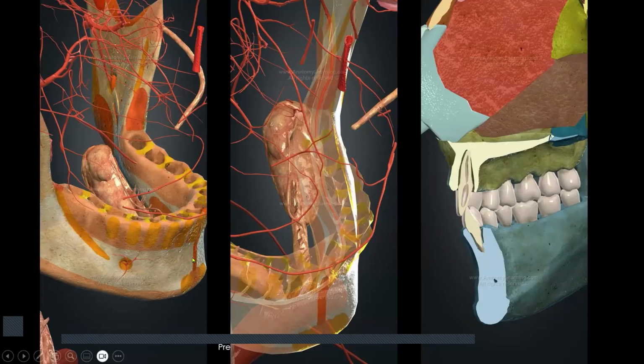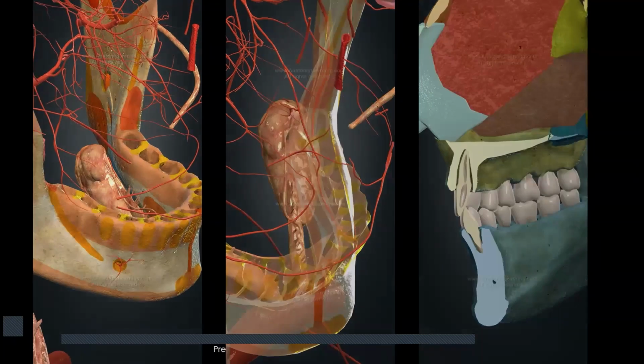So this is how we plan in a mandible for a cortical implant. The locations are anteriorly foramen to midline, and posteriorly the external oblique ridge or the mylohyoid ridge. Okay, this is the anterior and the posterior. When you place a lingual cortical implant, or engage the mylohyoid ridge on the lingual side, you have to take care of the submandibular gland, because this is a mylohyoid ridge over here and we place the implant in a tilted position here, so the submandibular gland comes here and you have to proceed with some protection. That will come in the discussions when we get to the planning.